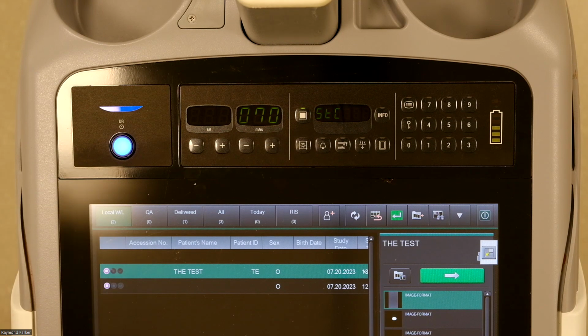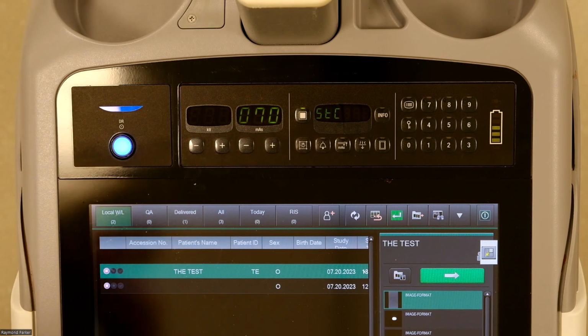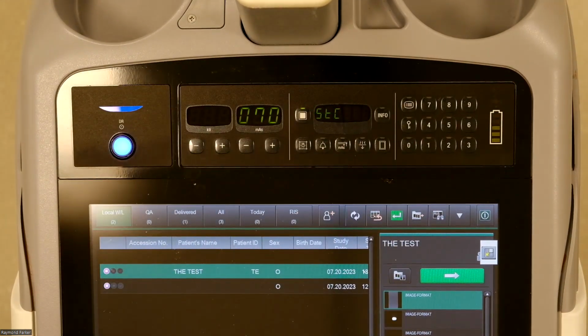I have seen situations where a site actually had 3 different PIDs active on a unit, meaning they had the 001875, they had an 11111, and then their engineer had put a 22222. The applications person was setting things in the user settings, and another operator would come onto the unit, and I'll give you the example.